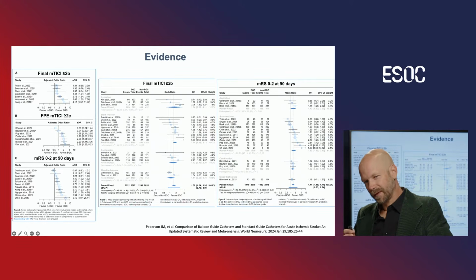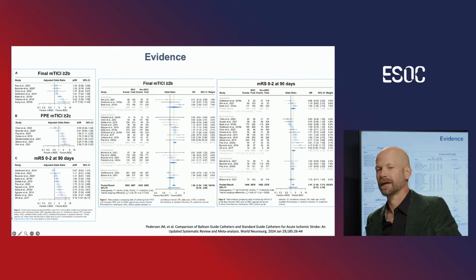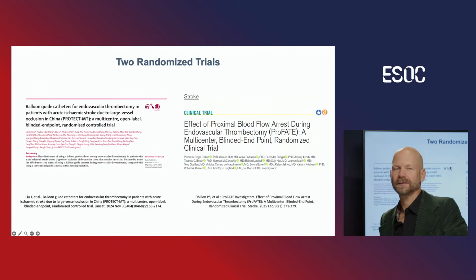So the evidence is not really high at this point, and these are all done with the first generation balloon guides, isn't it? Exactly. The ones you show here. Yes, exactly. Nearly all the evidence that we have was achieved with the older generation balloon guides.